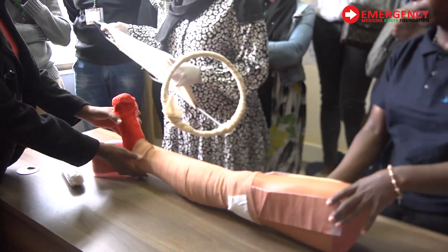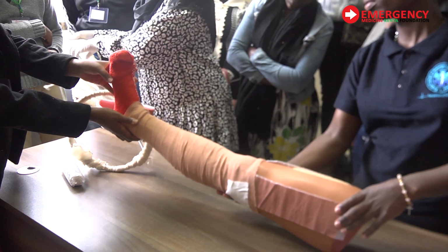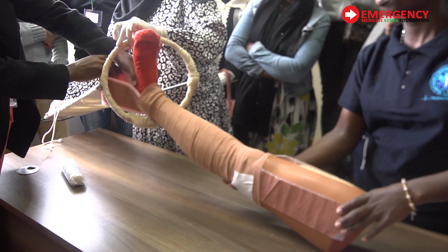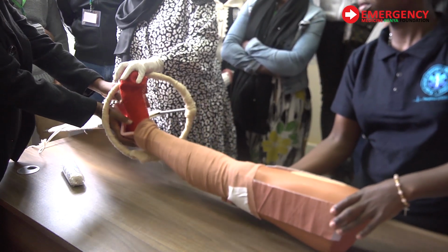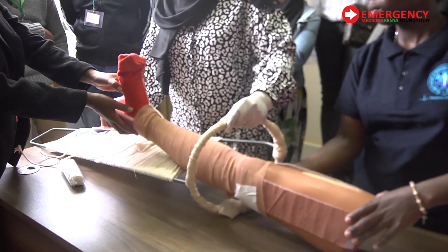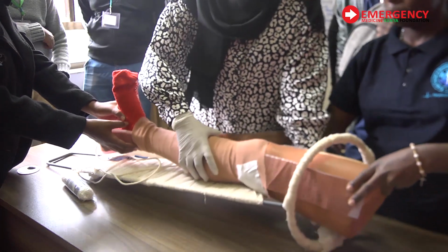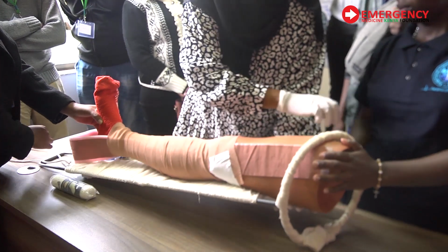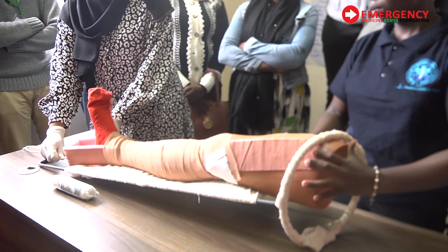All right, so what happens? My assistant will lift the leg as I try to place it in. Remember, doing all this, the patient is already in pain. Can you imagine if you don't have a block? What happens? Will you allow me to do all these maneuvers? Yeah, so you do this. Sometimes you can even use a pillow, okay, to make sure it's a bit comfortable. Then the next thing is actually to secure, okay.